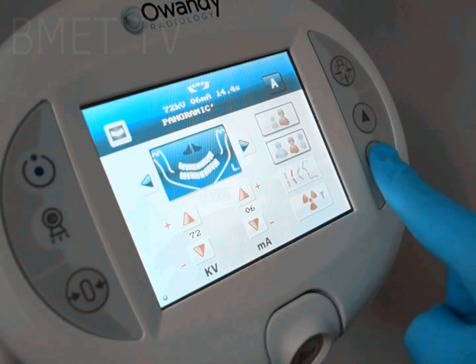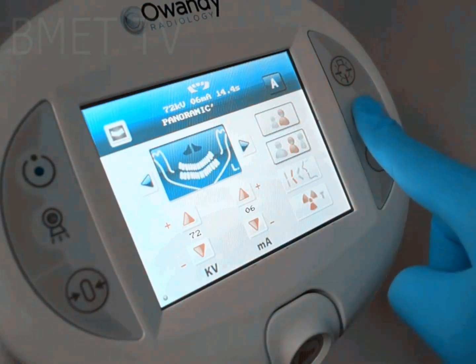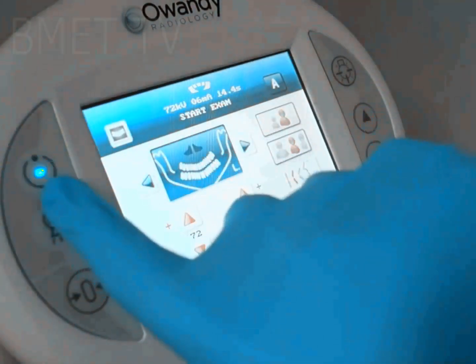For example, bone to muscle to air ratios in the abdomen differ from that of the chest area. So the subject contrast is said to be higher in the chest than in the abdomen. In order to image the body so that the maximum information will result, higher subject contrast areas require a higher kVp so as to result in a low radiographic contrast image, and vice versa.